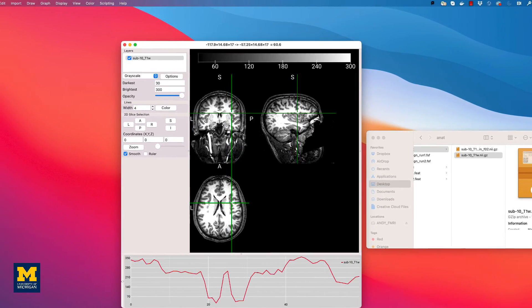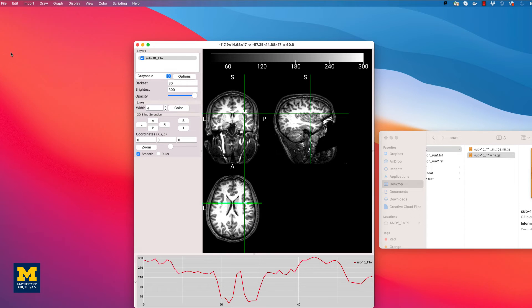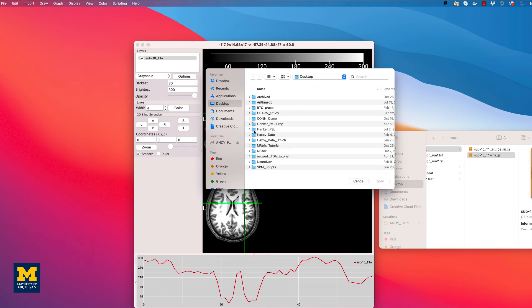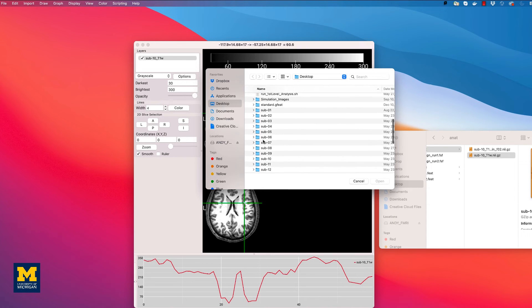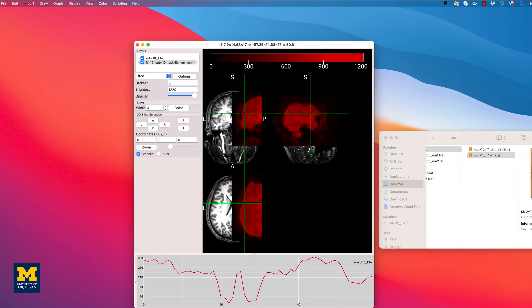Leaving the anatomical image loaded, click on File, Add Overlay, and select one of the functional images from the sub-10 func directory. In this case, we'll go to Desktop, Flanker FSL, which has already been processed in FSL, and then the sub-10 func directory, and we will select the first functional run of data. Recall that viewing both the anatomical and functional images can be useful for seeing how far apart the images are before any preprocessing has been done. Images that start farther away from each other may need a larger search area during co-registration in order to find a good fit, or the origins may need to be manually centered before doing any further preprocessing.